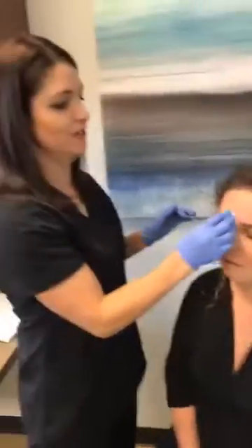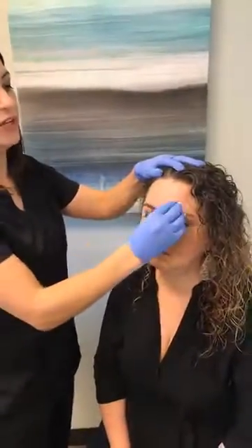So I would recommend, if you have a party to go to or want it to work, she'll start to notice a difference in about 3 days where she can't frown quite as well as she could before. The full results will be about 10 days up to 14. I never retreat anyone, or if they needed more, I don't add it till then. So I would do it a good week or two before you had an event, just so it works. Okay, perfect. All right, so you can see her bumps already flattening out.